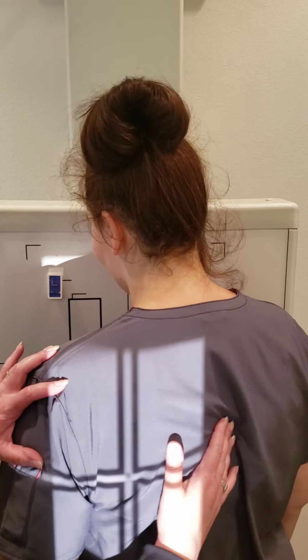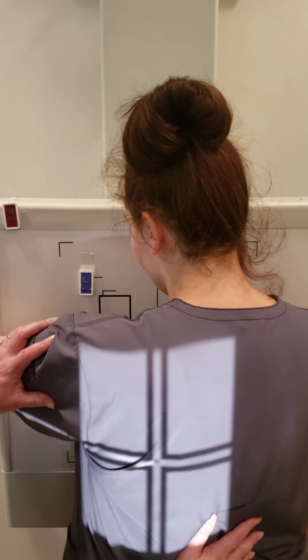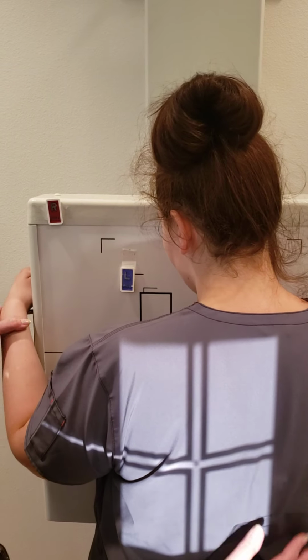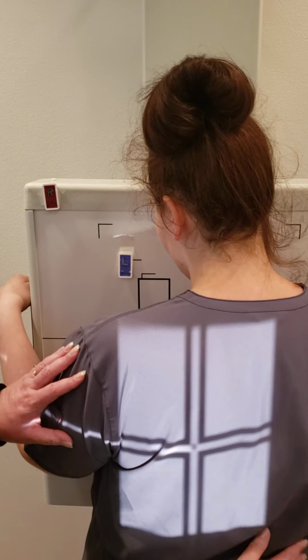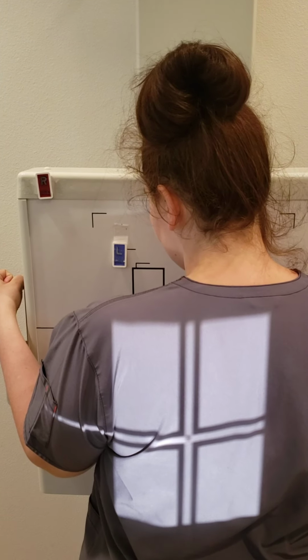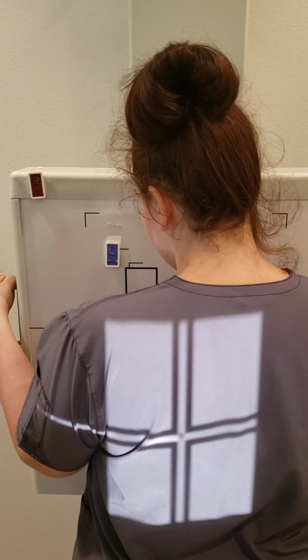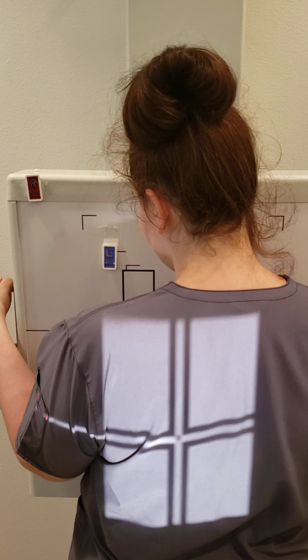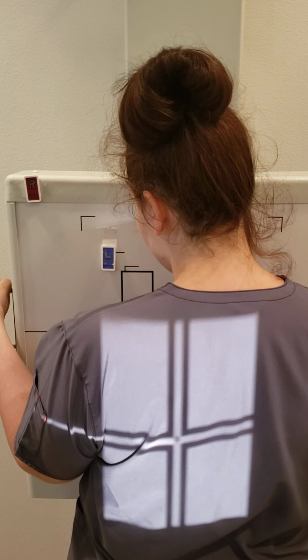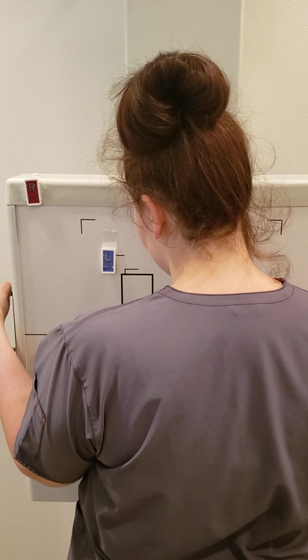So I'm just going to bring you here. We've got the spine. You can bring your hand up here if you want to. Just hold on there. All right, and again for upper ribs, take a nice deep breath in and hold it and expose, and you can breathe. And that is the rib series for unilateral, anterior, and posterior ribs, AP, and obliques.